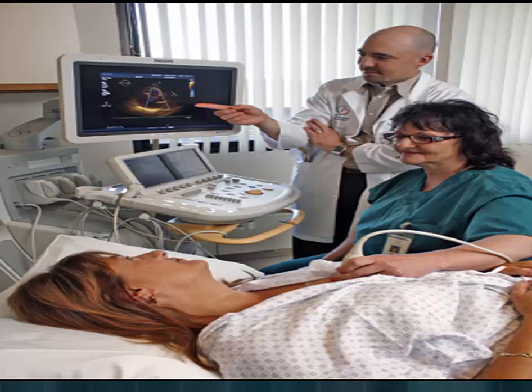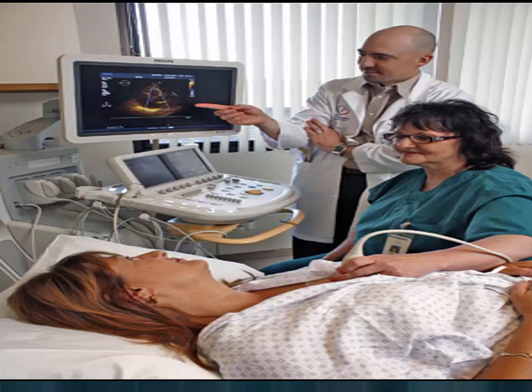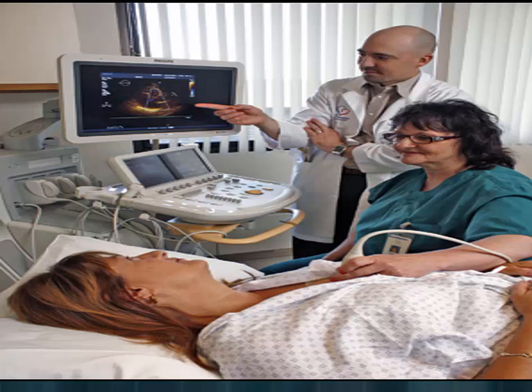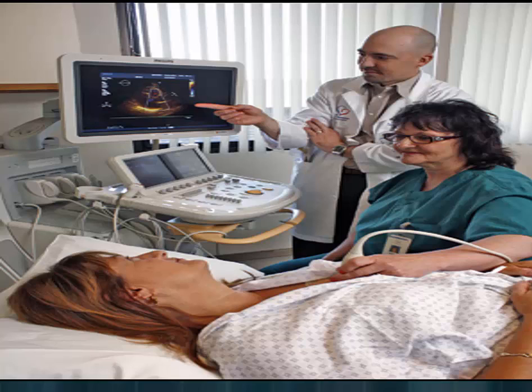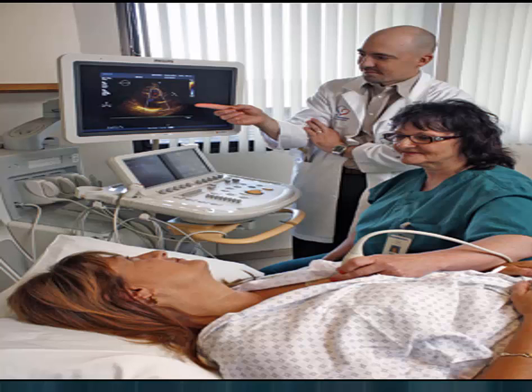Echocardiography uses sound waves to reveal size, shape, and motion of cardiac structures. It evaluates heart wall thickness, valve structure, and differentiates murmurs. An echo can also pinpoint areas of heart muscle that are not contracting well because of poor blood flow or injury from a previous MI, and detect possible blood clots inside the heart, fluid buildup in the pericardium, and problems with the aorta.